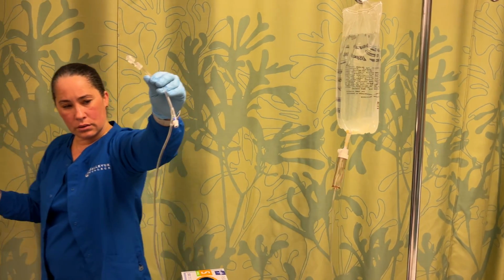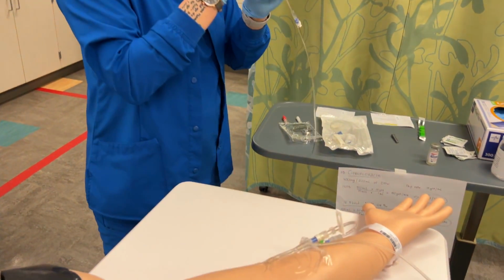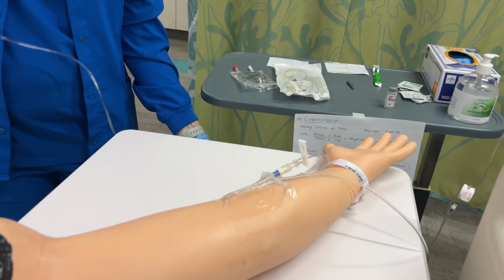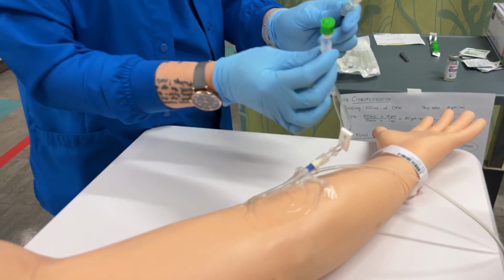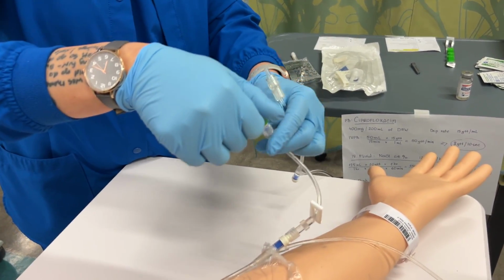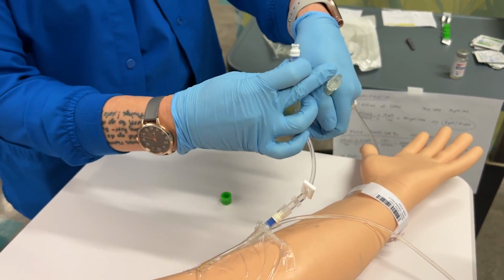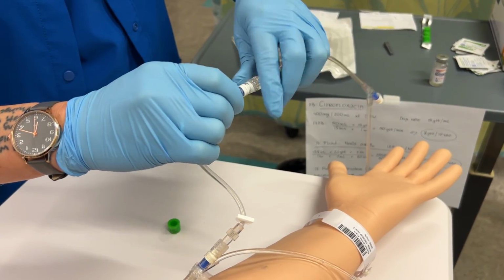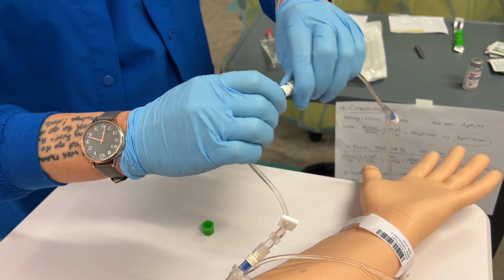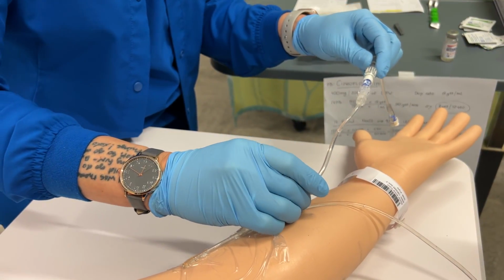So we're going to put this on the patient, making sure to unclamp this. This has alcohol in it, so it's clean. So I'm just going to take that off, and we're going to attach this end here. Make sure you screw this part on, because this is what's going to lock it on and keep it on there. And then you're going to want to undo the clamp on this.